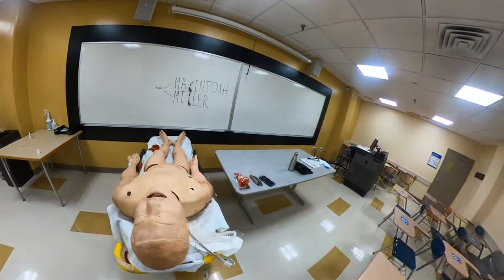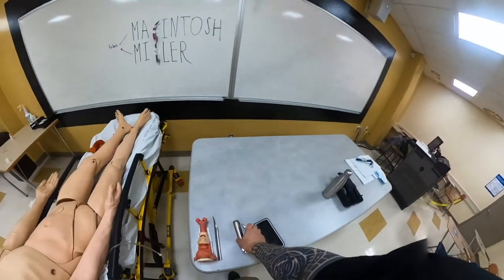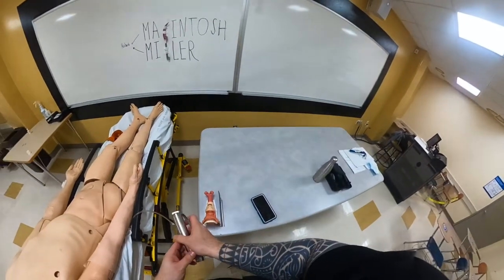Hello, my name is Nikolai Yusupov, and in this video I'm going to show you the two different blades — my McIntosh and Miller — and how to intubate the patient with these blades.